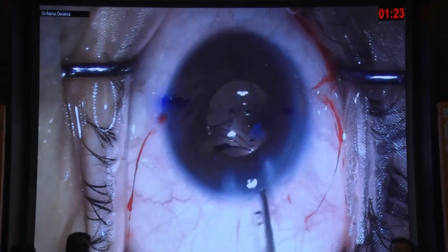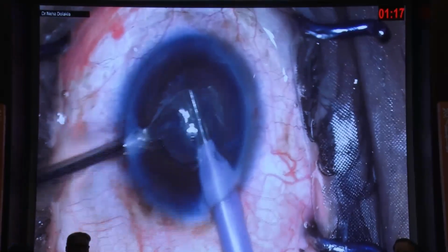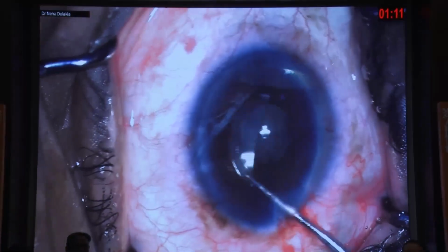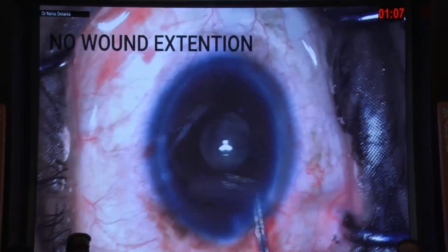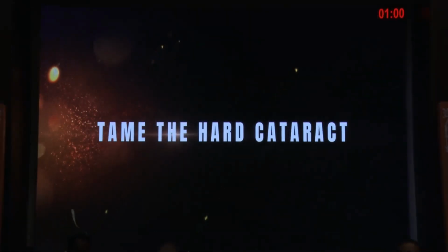However, sometimes we have an open posterior capsule also. You can see the new toric lens being implanted so well. This is a patient who had a YAG laser done. So first I had to cut the IOL, or rather slice the IOL into 3 parts, and then I have implanted a 3-piece in the sulcus.